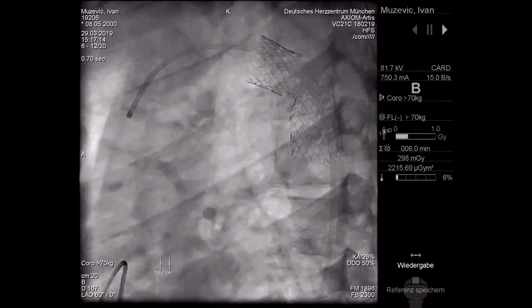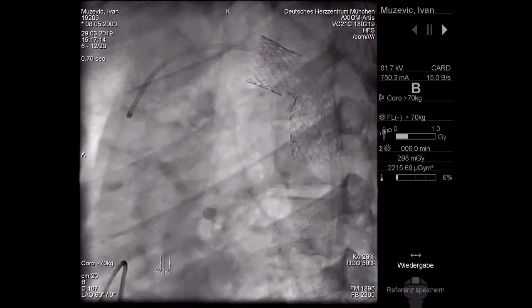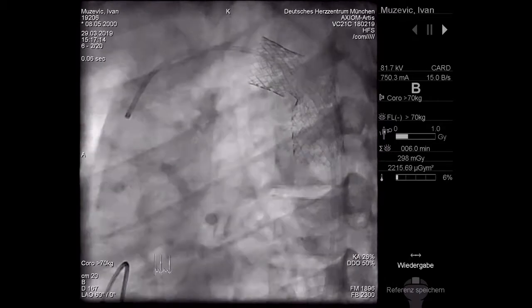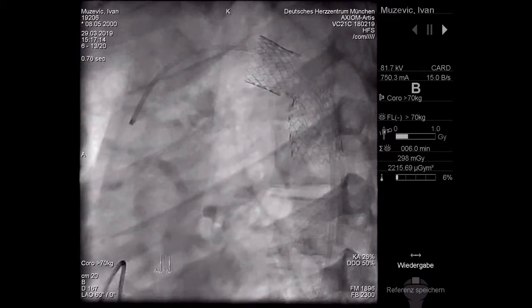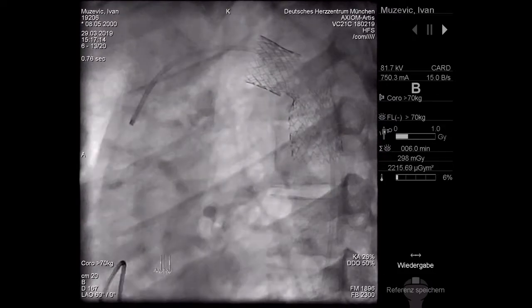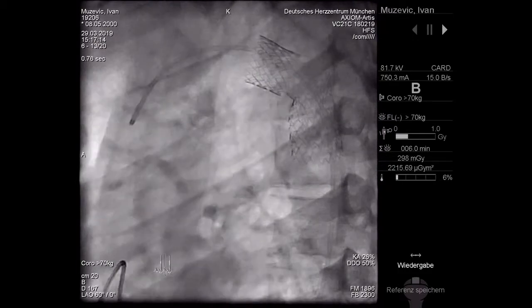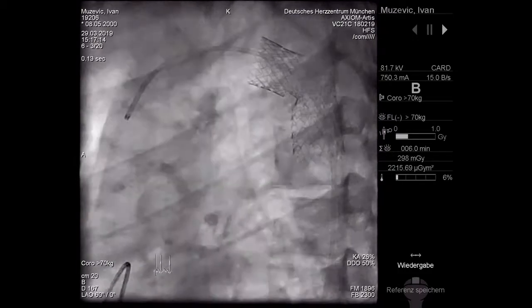Oliver, don't you think that has anybody concerns that we dislodge the just implanted stent? Yes, great concern. I wouldn't take an Atlas, because the Atlas will be really, really straight, and I think you will dislodge the first stent, the one you placed just now.